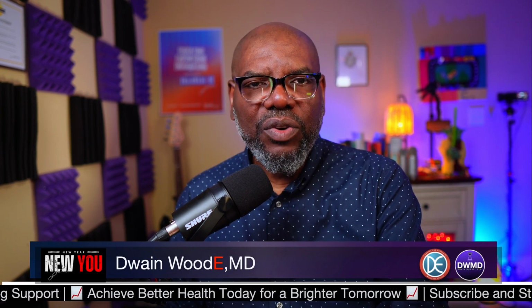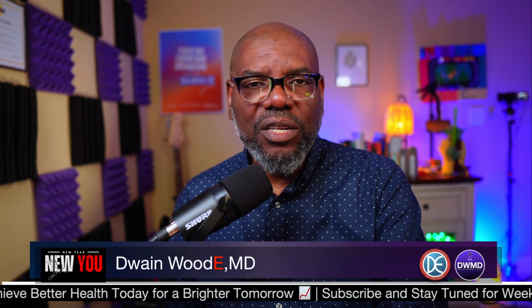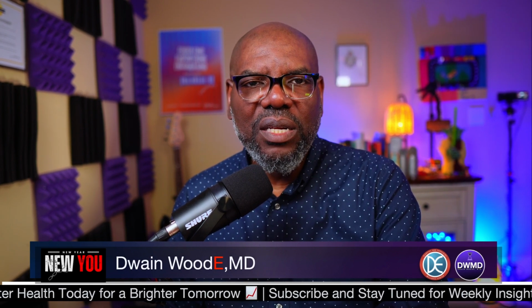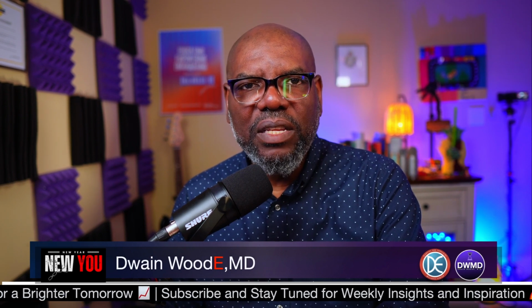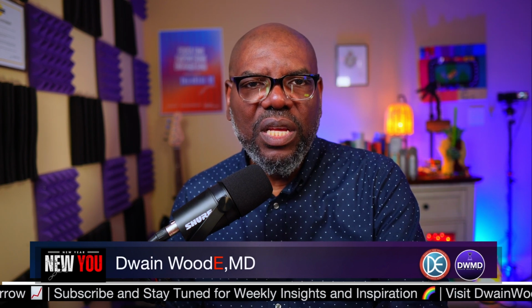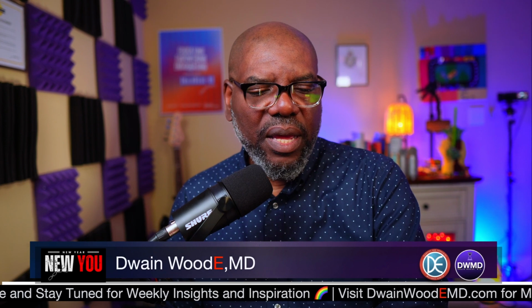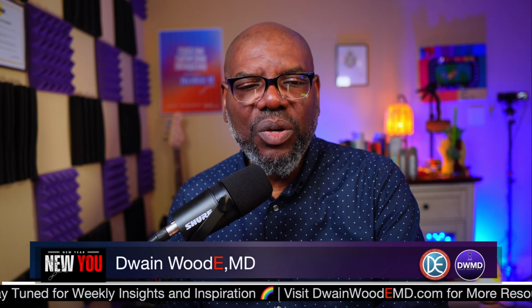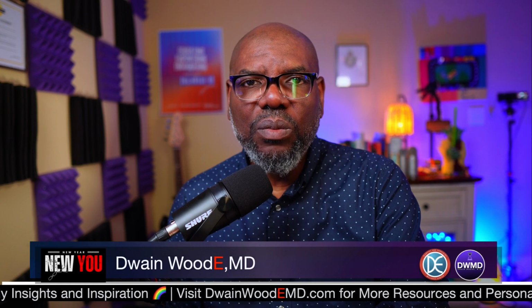Well, they're coming out with versions of this right now. Your doctor, even if you are not diabetic, can prescribe it. The insurance may not cover it, and then you'll have to pay out of pocket. But they're coming out with versions that, I'm told, will not require a prescription. So we look forward to seeing some of that and seeing other things that may be coming into the market.